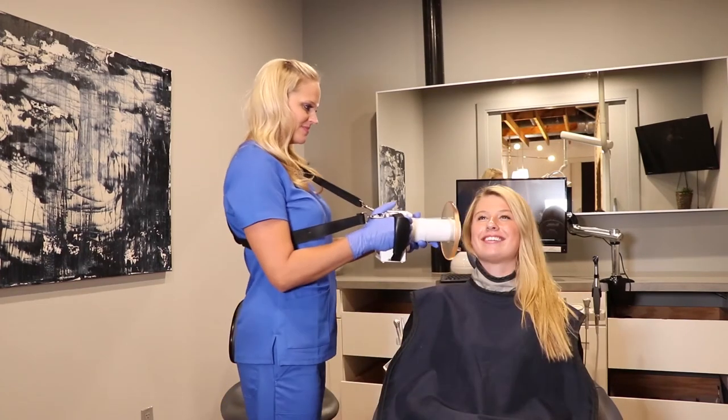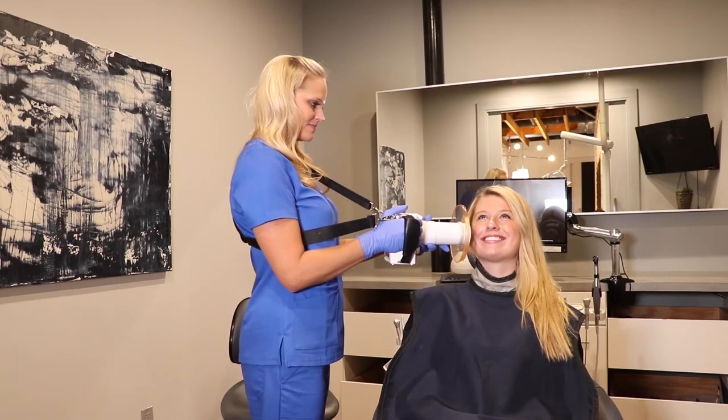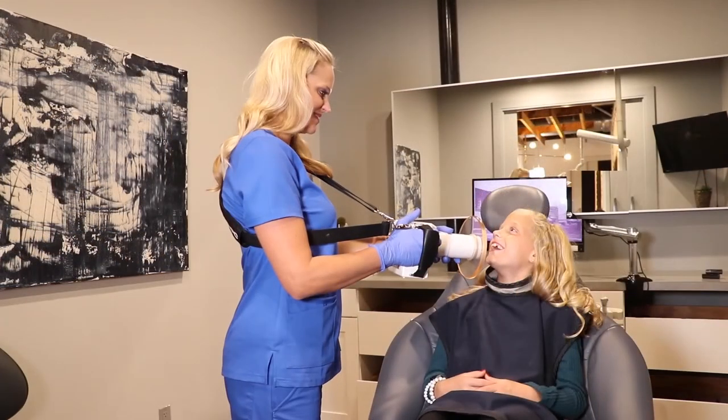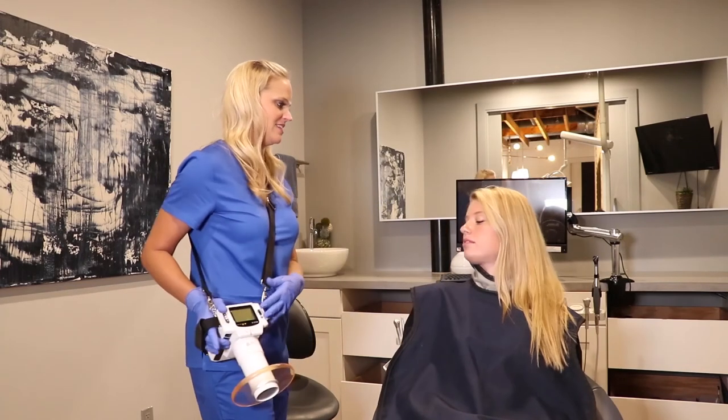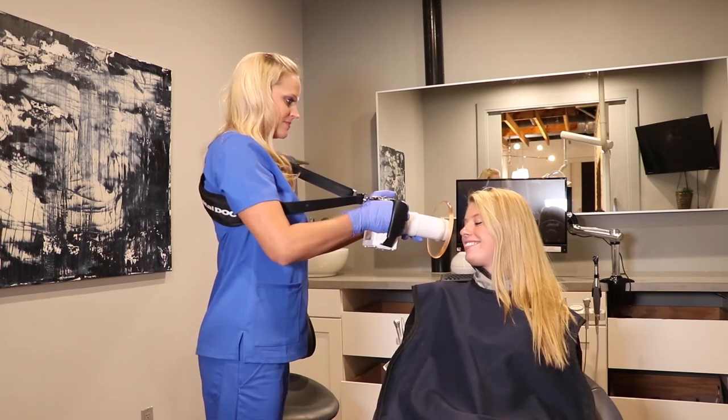There are multiple positions for anterior PA, for adult and pedo. First, adult. The anterior mandibular PA, patient will tilt their head up. The anterior maxillary PA, patient will tilt their head down.